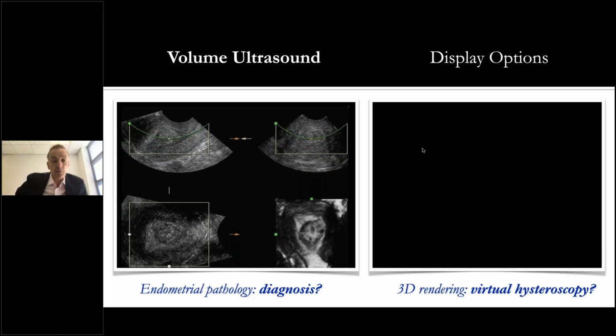So in this first image, you can probably guess that the fibroid is affecting the cavity, but when we've acquired the volume and we look in 2 planes, we can see in the C plane at the bottom, yes, there's a fibroid, but by rendering the image, so we're just shining some light, we're trying to accentuate the tissue density and the contrast between the endometrium in white and the muscular tissue of the myometrium in black. And then in between, we have this fibroid that you can see has an endometrial covering on it, but this is essentially a more solid structure.